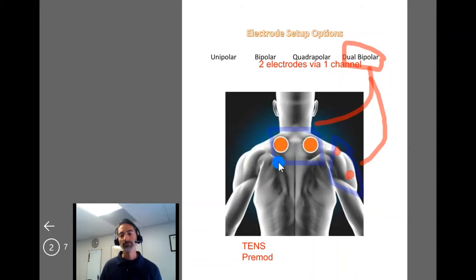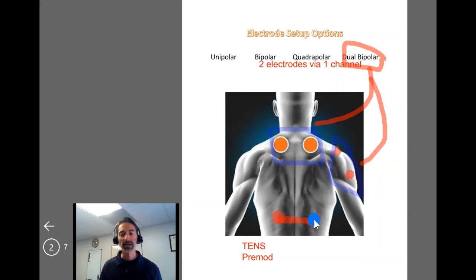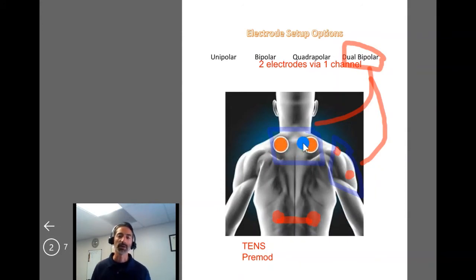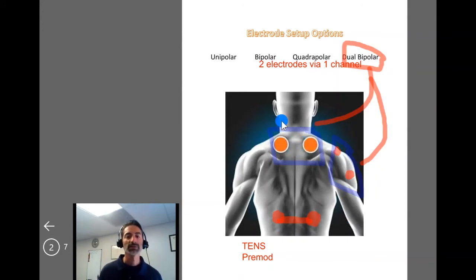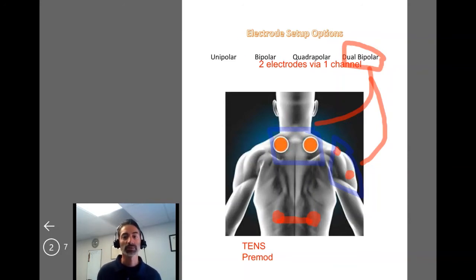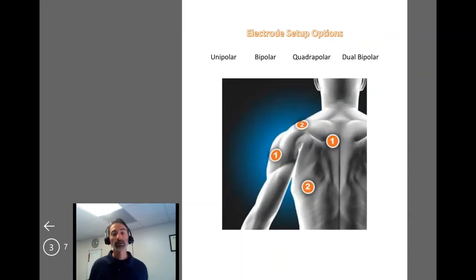Another example: someone with a whiplash injury from a car accident who also has lumbar spine pain. You might do a dual bipolar setup with two electrodes on one channel at the low back and two electrodes on a second channel at the cervical spine. That's an example of bipolar and dual bipolar setups.